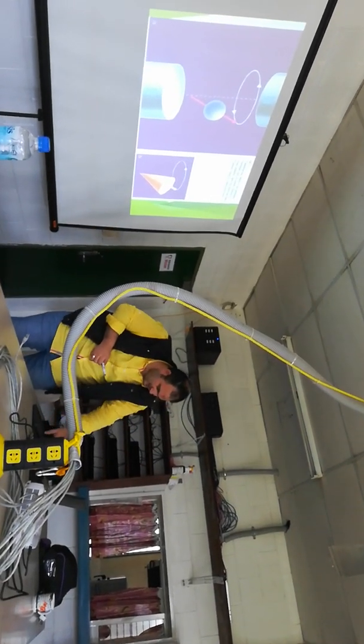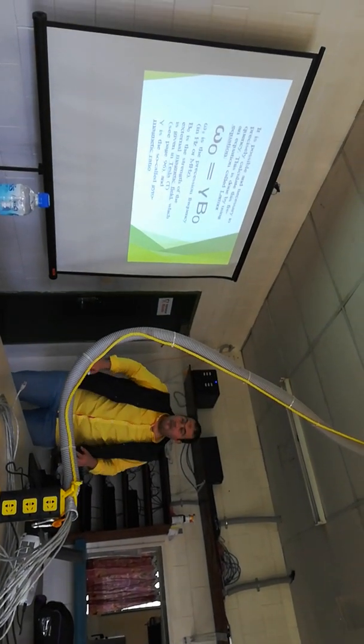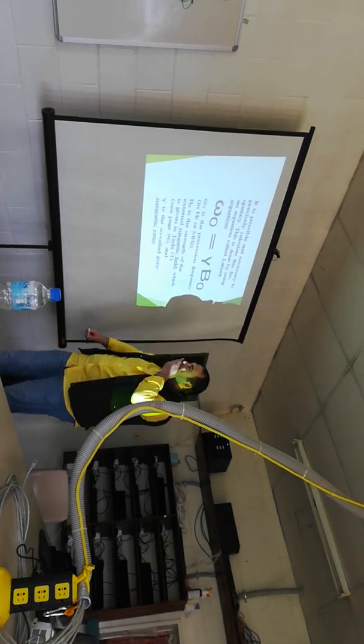So, this equation for omega, the precession frequency, you will find here B naught is the strength of the external magnetic field. Now, the unit of magnetic field is Tesla. This machine is 0.4 Tesla, another one is 1.5. Increasing the magnetic field strength just increases the precession frequency. Because now you will affect a large number of protons, okay? So you will get the image very fast.